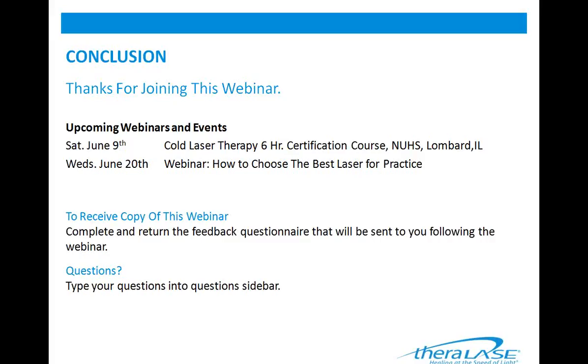Okay, so there are several other questions here about contraindications. One is about pregnancy, one is about age, and just to respond to these, pregnancy is not a contraindication, but treating over a pregnant belly is a contraindication. So just don't treat right over the pregnant belly.